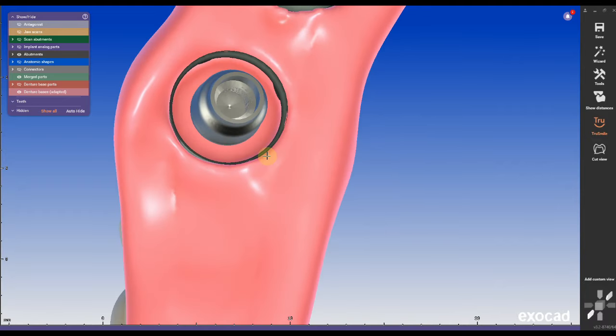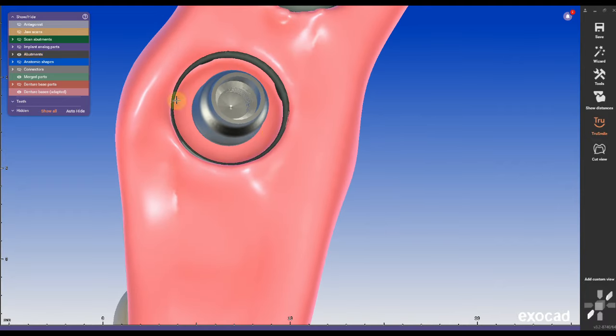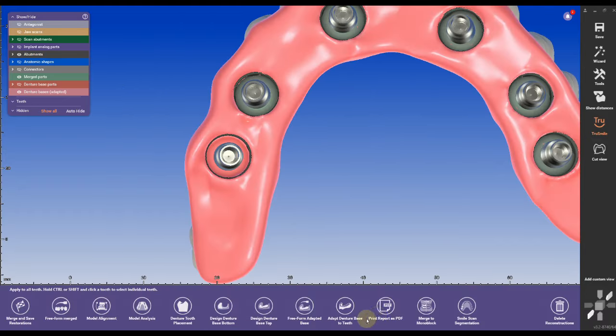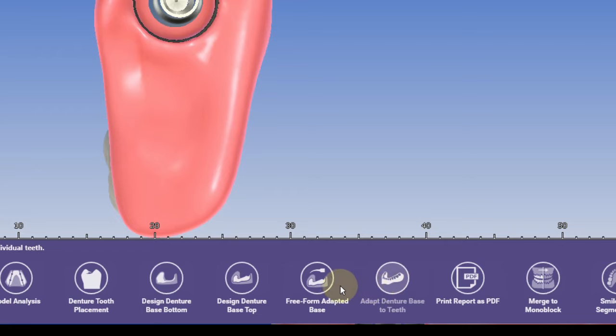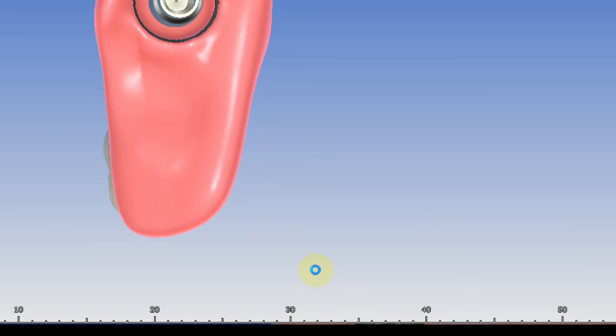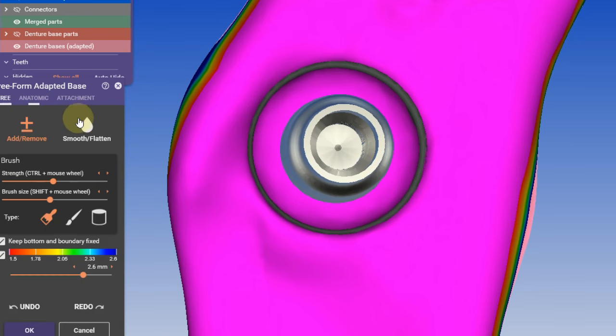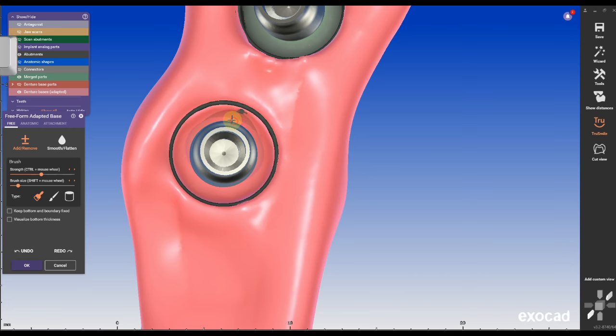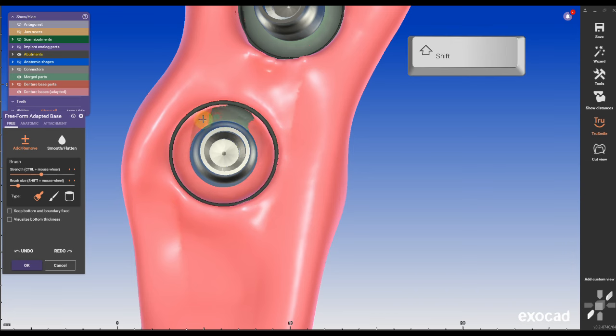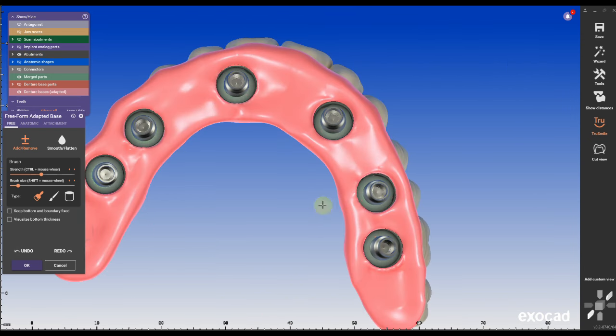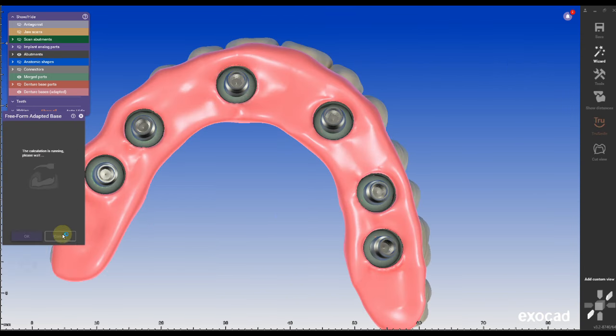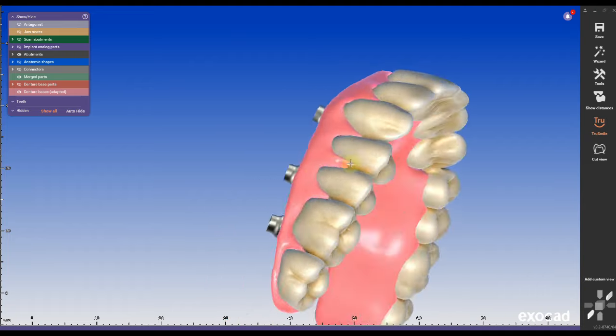If you make the abutments visible in Exocad 3.2, you can easily spot areas where the spaces for the housing was modified too much and the pink is bleeding through the housing. We can go back into freeform adapt base, select the small size brush and subtract or modify the area while holding shift key on the keyboard.